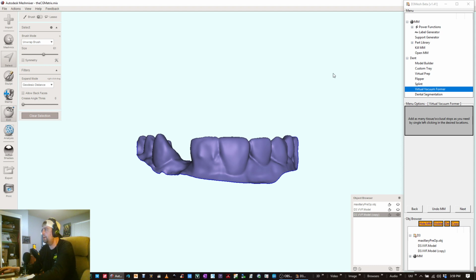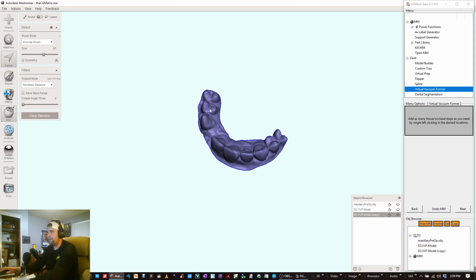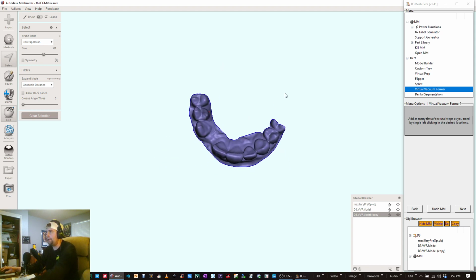If you don't have a Moonray, get one, because unfortunately Formlabs does not support this resin yet. Maybe you can get it to work like that. I haven't looked into it recently. But actually, I'm going to take that back. Do not do that. Only use resins on supported 3D printers. Don't try to get things to work, especially biocompatible ones, on other printers. It's just not a good idea for a lot of reasons, including FDA considerations.